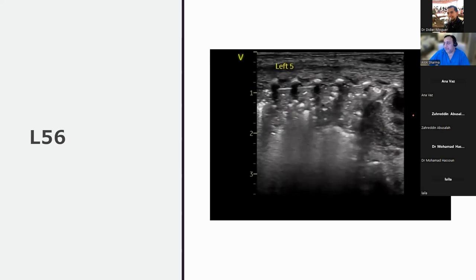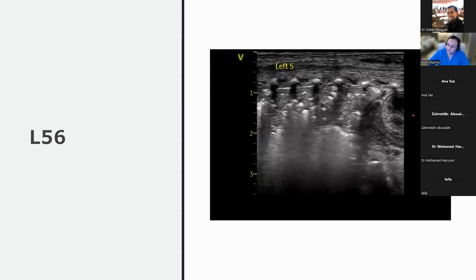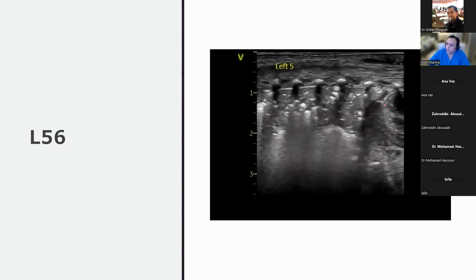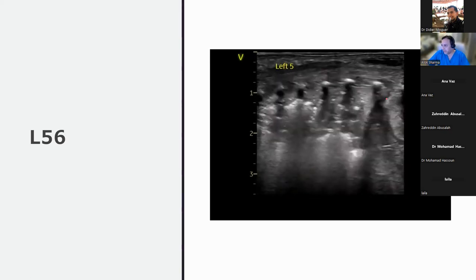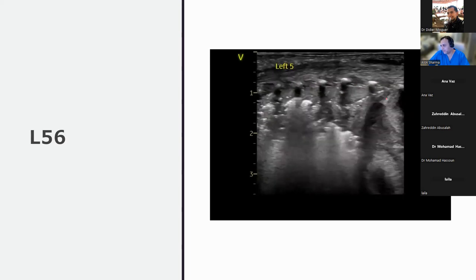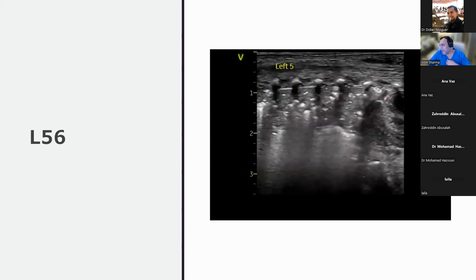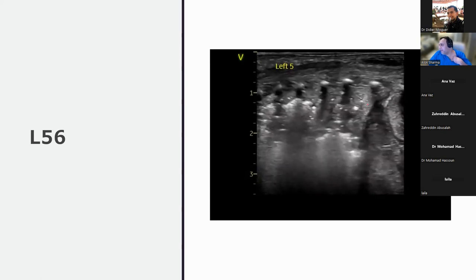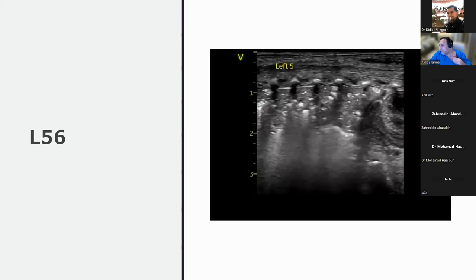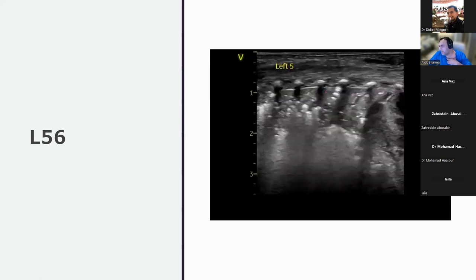There's some very nice signs over here. Here's a bronchogram. Is it static or dynamic? What do we think? So let's throw it out to the audience, guys. What do we think? Static or dynamic? For me, some of them are dynamic. Maybe just one over here that I can see. Yeah. But overall, I'd say this is static, the majority.